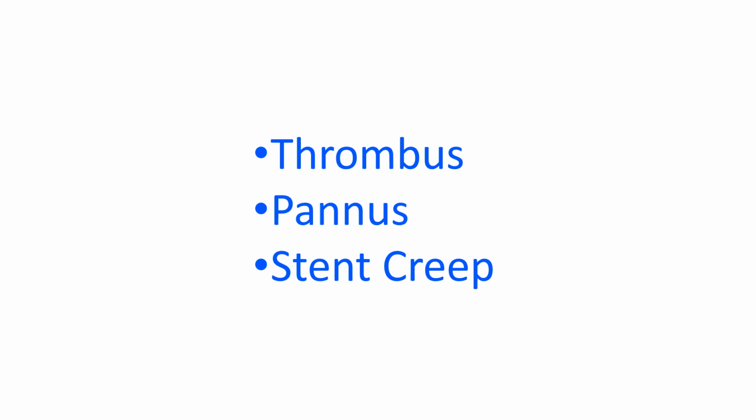Stent creep was due to ultrastructural deformity of polypropylene used in the valve stent. Newer stent materials resistant to such deformity were developed after this was noted in explanted Hancock bioprosthesis.